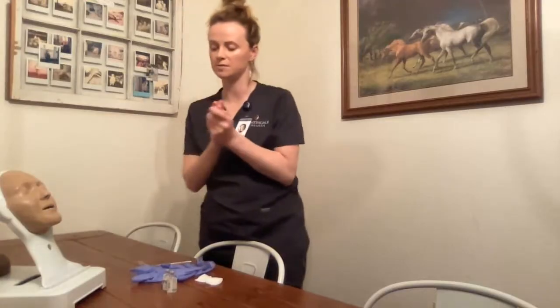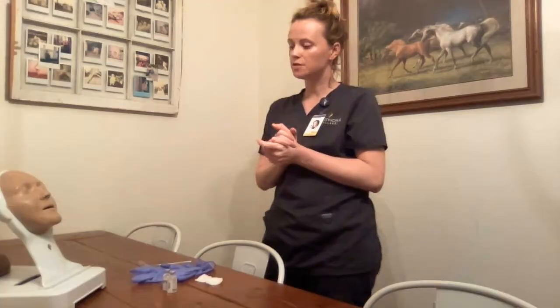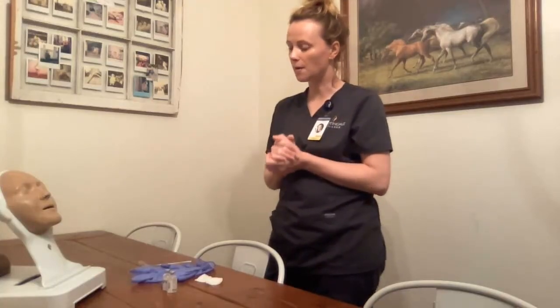I perform hand hygiene and introduce myself to the patient. Hi Mrs. Smith, my name is Emily. Can I please have your name and date of birth? I verify with the wristband — that counts as my two-patient identification. Mrs. Smith, do you have any allergies I need to be made aware of? No allergies.